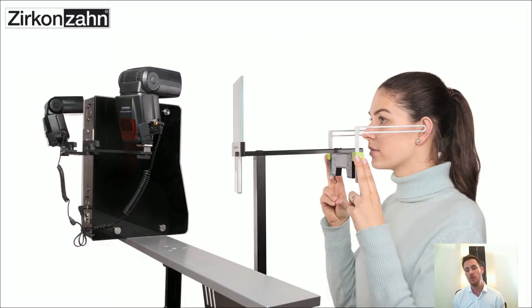And then we just place the Face Hunter in front of the plane finder, and we are able to capture now the individual head position, and via those scan markers here in the front, we are able to transfer it one by one without any kind of rotation changes into our system.